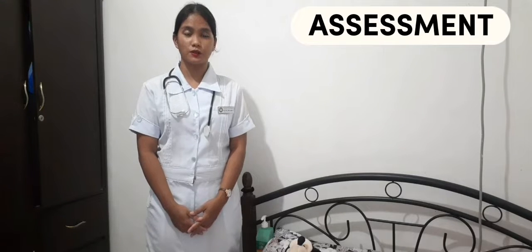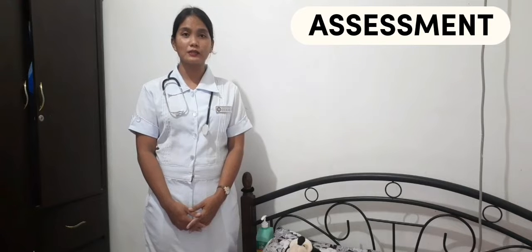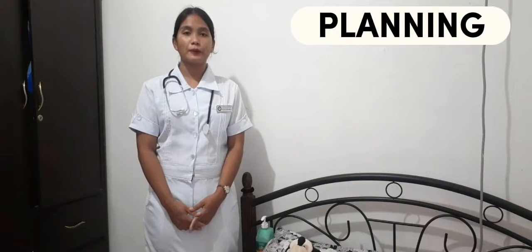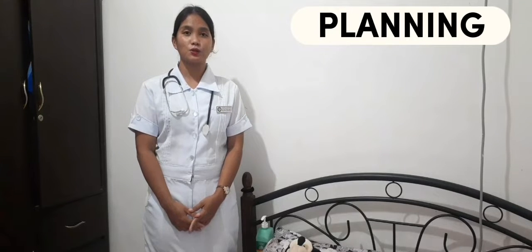So, let's proceed. First thing that we need to do is to check for the doctor's order. Then, assess the patient's vital signs including pain, mental status, and motor impairments. The rationale for this is to avoid medical error and to have a baseline data. Next is to prepare the necessary equipment and supplies. Rationale for this is to save time and effort and to ensure the availability of the equipment.